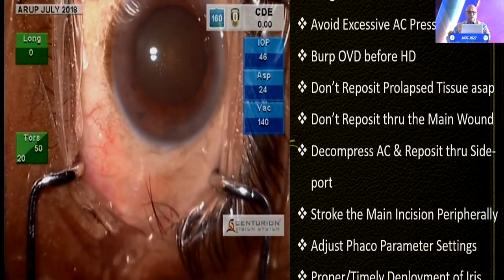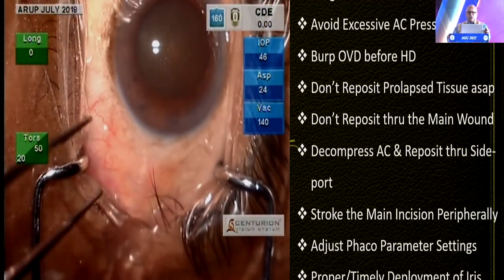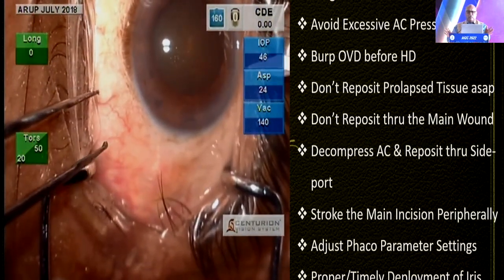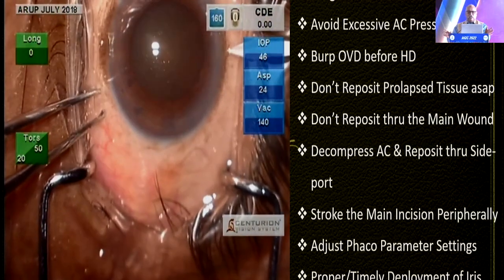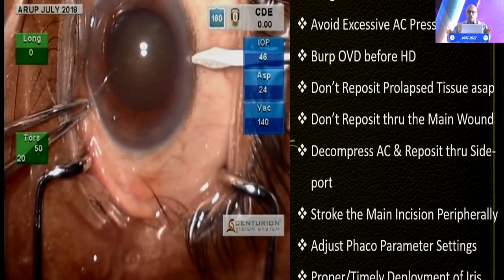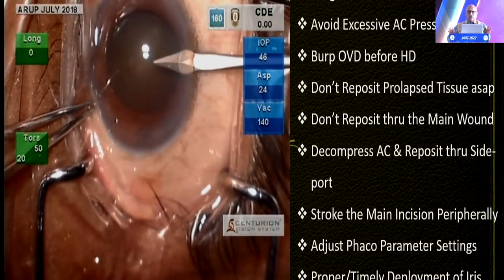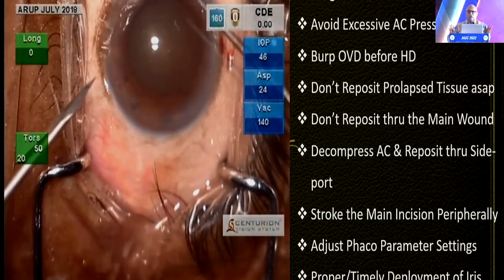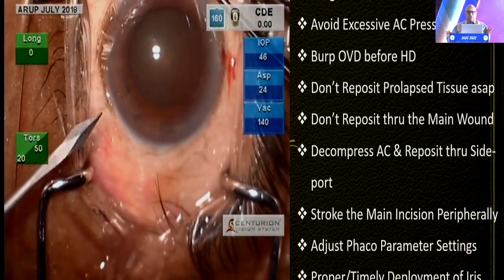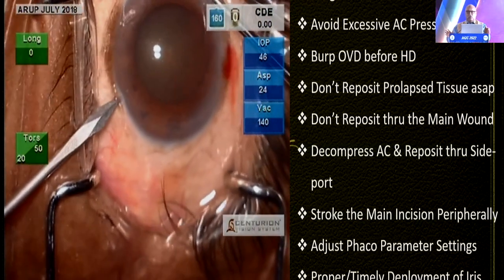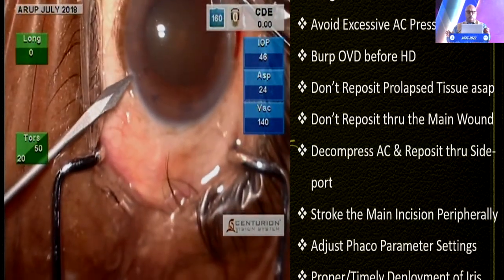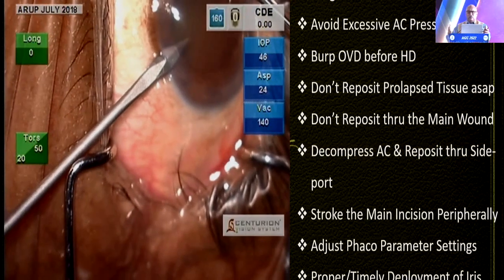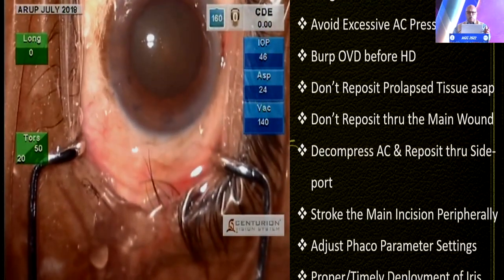We took him up on topical anesthesia; a temporal clear corneal incision was planned. The inferior paracentesis is made with the 20-gauge MVR blade. We have to ensure that the corneal incision should be long — they should not be borderline. The superior paracentesis is small because that is the site where we are manipulating instruments, and if it is a floppy iris situation, we don't want the pupil to be prolapsing out.